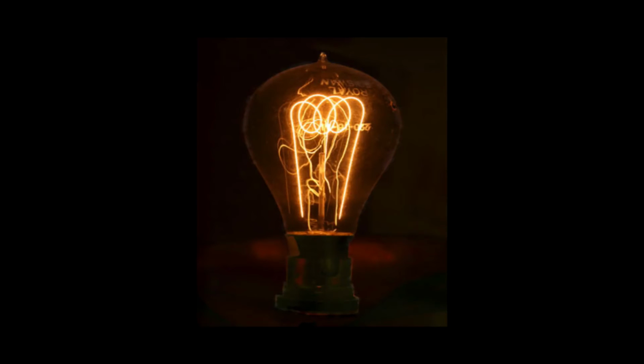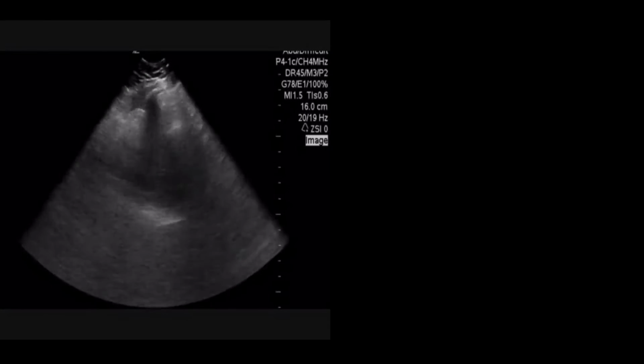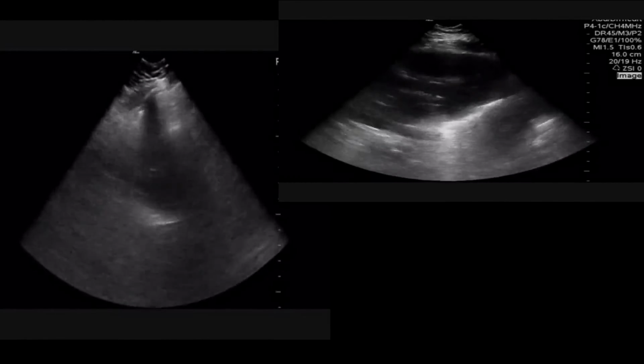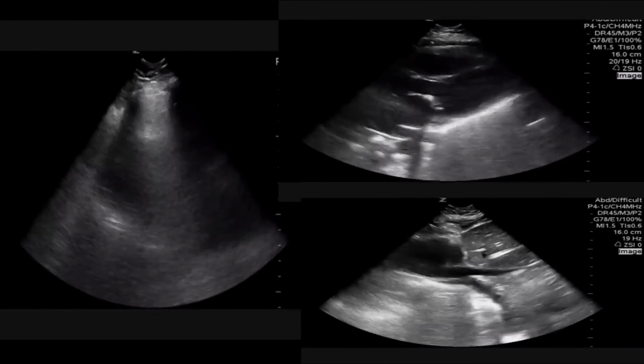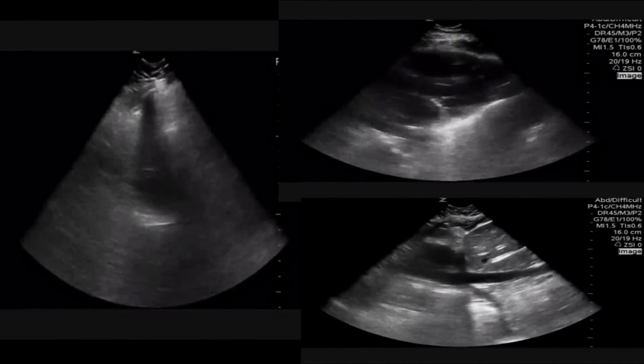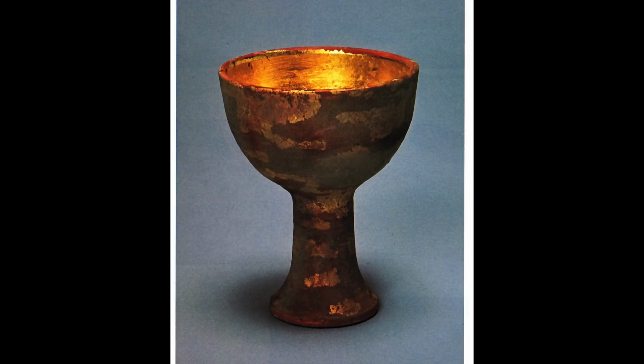This patient has acute exacerbation of mitral stenosis. Now the picture totally fits. She's got pulmonary edema because fluid is backing up through the left atrium into the lungs. The cardiac function is good because it's a valvular issue, and the IVC is very collapsible because it's not a volume overload problem. So we get cardiology involved and also contact cardiothoracic surgery in case the patient needs an acute valve replacement.